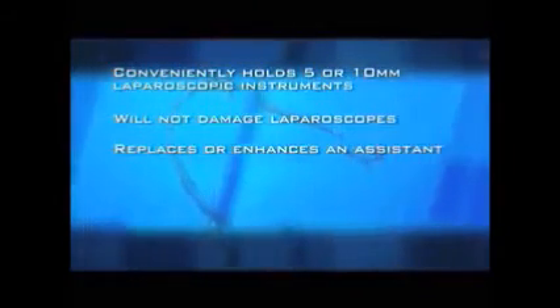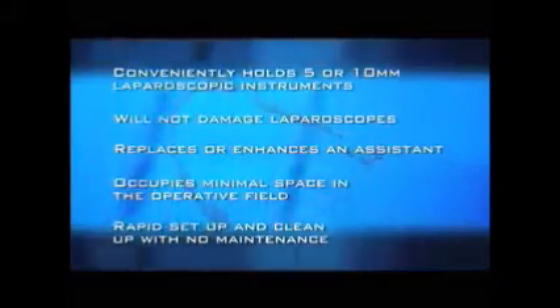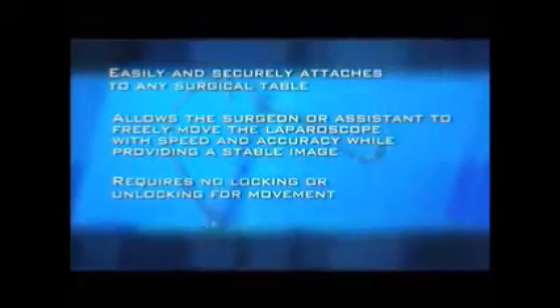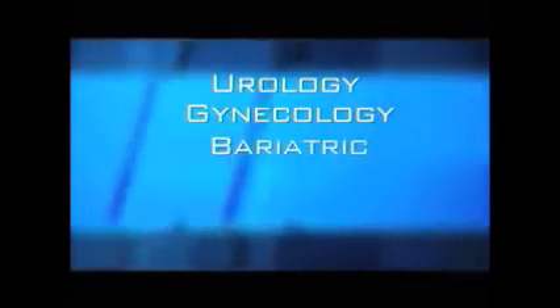Key benefits of the laparostat: conveniently holds 5 or 10 mm laparoscopic instruments; will not damage laparoscopes; replaces or enhances an assistant; occupies minimal space in the operative field; rapid setup and cleanup with no maintenance; easily and securely attaches to any surgical table; allows the surgeon or assistant to freely move the laparoscope with speed and accuracy while providing a stable image; requires no locking or unlocking for movement; low maintenance and easy to use. The laparostat is recommended for urologic, gynecologic, bariatric, and general surgeries.